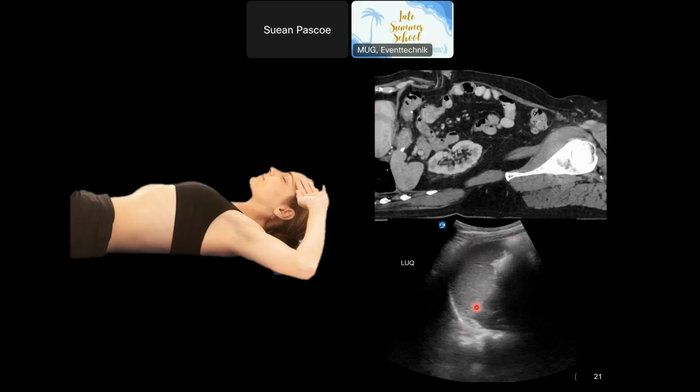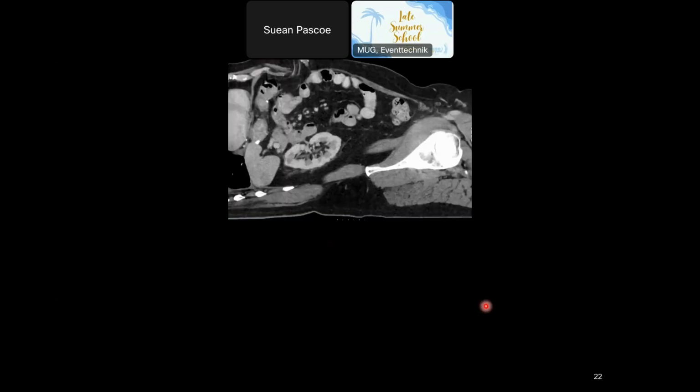The spleen is a crescent-shaped organ. It looks very, very similar to the liver. The shape is what gives it away, and it should be in the normal patient. It's usually quite a bit smaller. There's quite a big variety of normal spleen size in your normal patient. Some people have just a tiny sliver of tissue, and other people have splenomegaly associated with other disease processes. But you're looking for that crescent moon shape, and you can just see the top of the left kidney here.